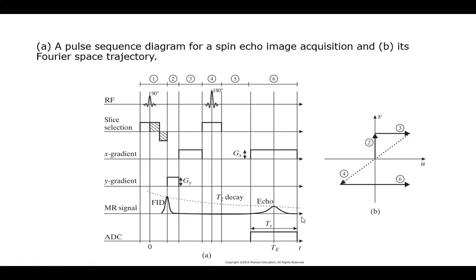So if we were just doing a FID measurement and I wanted the bottom, I just perturb down, perturb over, read out. That's why if you can do FID measurements, do a FID measurement. It's simpler, it's faster, everything else. Echo gives you a much stronger signal, but now you have to do something a little bit different.